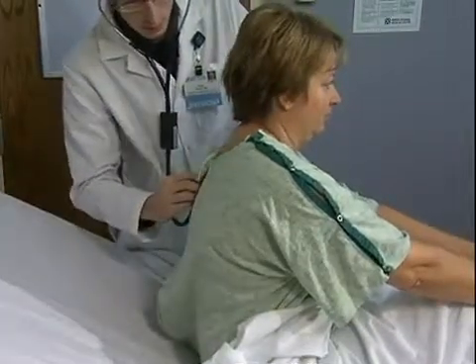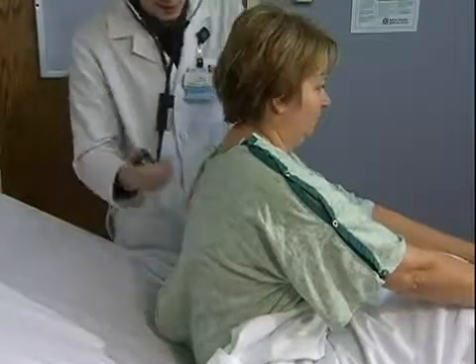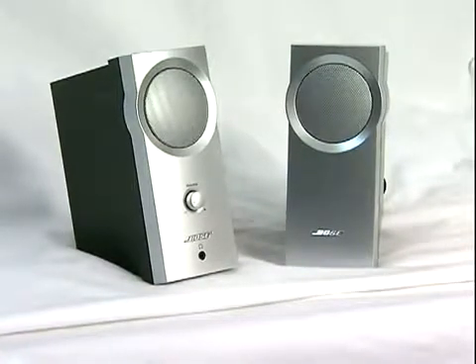The button pressed to start the abnormal sound should only begin when the student listens on the correct spot. Listening on external speakers or earbuds may help the standardized patient by hearing the sounds while they are practicing.